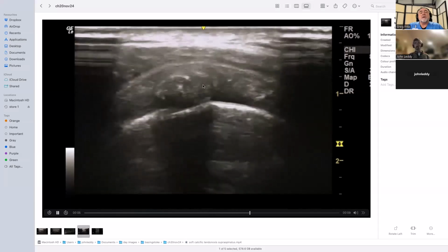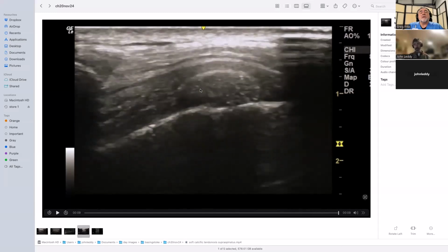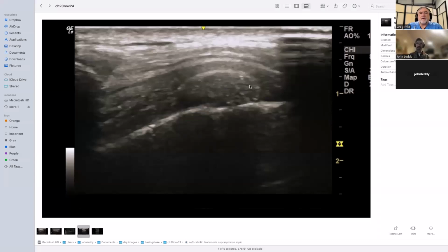But that's the sort where I would expect to often get quite a lot of chalk out when I stuck a needle in it. Earlier to this, would you be taking out more clear material? No, when it's soft, when you can see through it, it is often a bit like toothpaste. And so when you stick a needle into it, if you could stick a big enough needle and flush some fluid, you will often get calcium back in as you flush into your syringe.